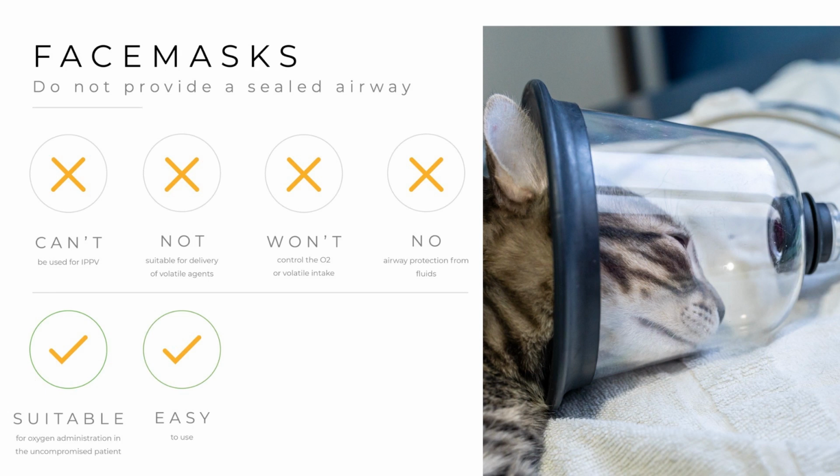They are suitable for the delivery of oxygen in the uncompromised patient, for example, when you are pre-oxygenating your patient prior to anaesthesia, or upon recovery when an alternative airway device has been removed. They are also very easy to use. You simply need to place the patient's mouth and nose into the device.